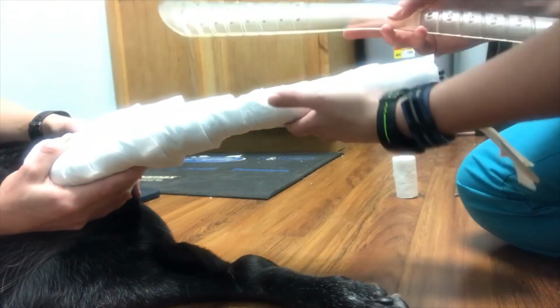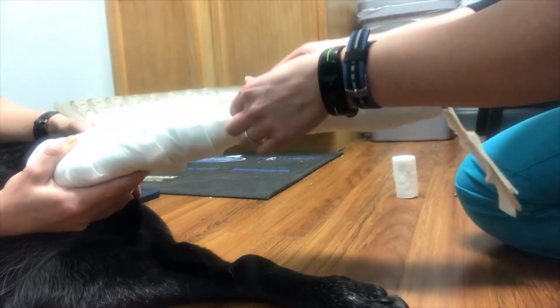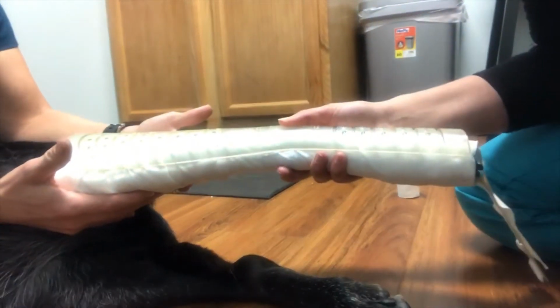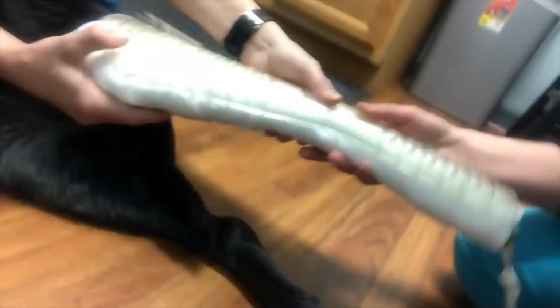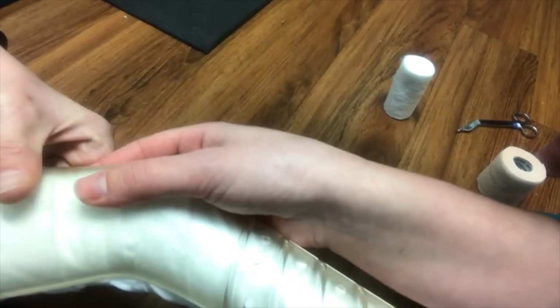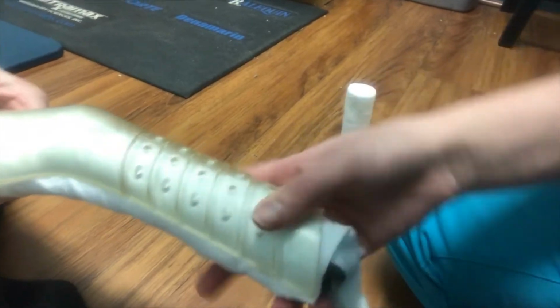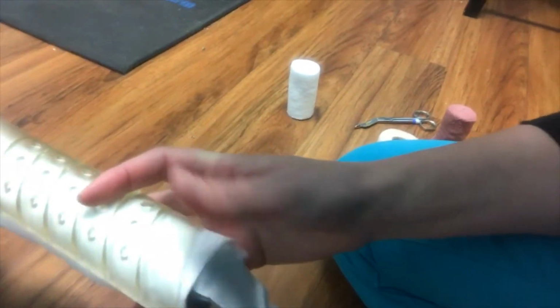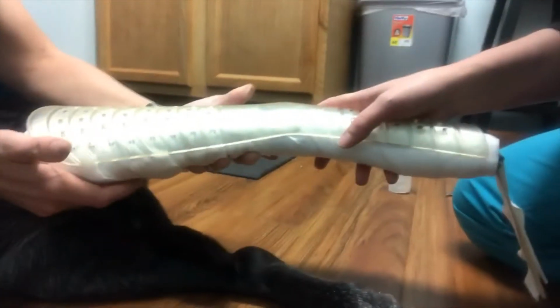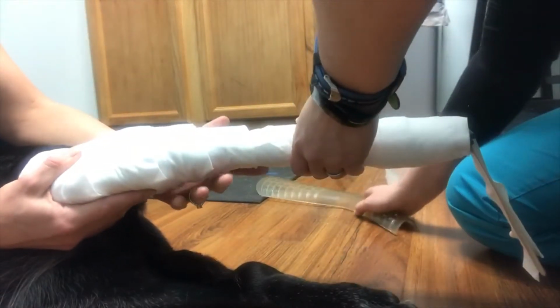Now at this point in time, before I proceed further, I'm going to check my splint. I'm going to lay it up against the patient and make sure I don't need any padding elsewhere. So here, if you kind of hold it there, Jess, and demonstrate here that the cotton comes up above where the splint ends. That way it will prevent rubbing there. Another pressure point is right here around the hock. It's padded enough that it's not going to leave pressure sores. And it is also distal enough that the splint will bear the weight versus the limb, as the purpose of the splint is to bear the weight. So now that I know that I'm set with that, I'll proceed to the next step.